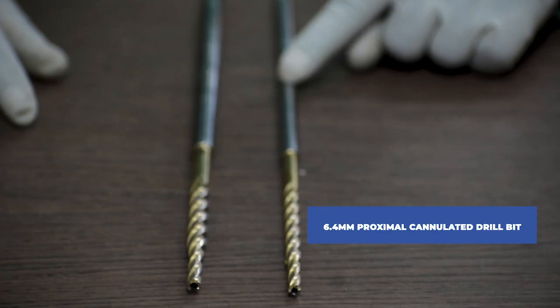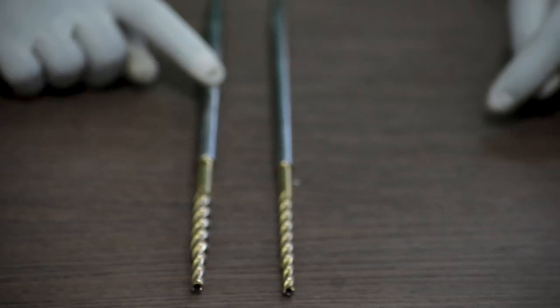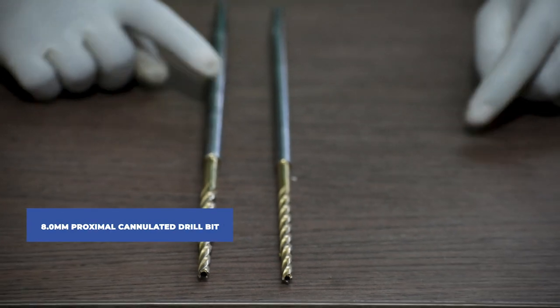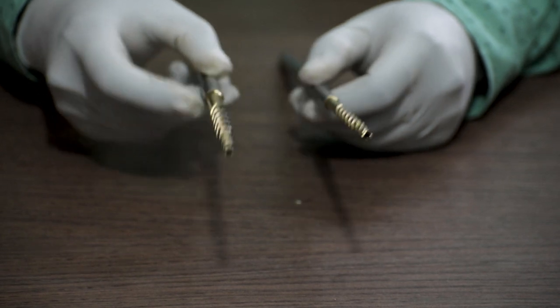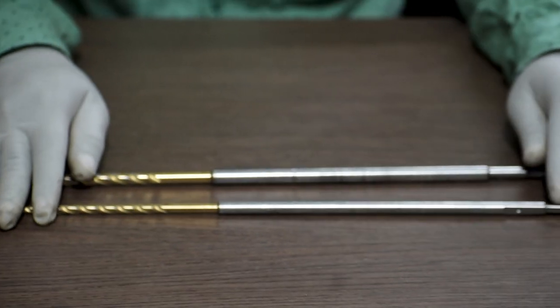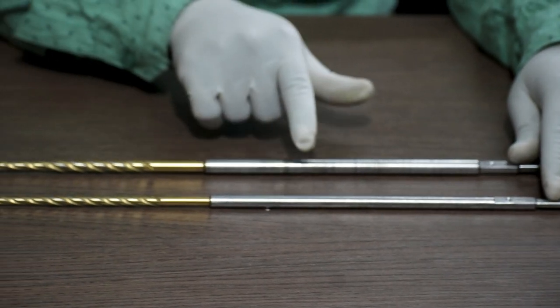Next is the T-handle chuck with key. This one is the 6.4 mm proximal cannulated drill bit, and this one is the 8 mm proximal cannulated drill bit. As you can see, these are cannulated. They also come with measurements — as you can see, there are markings on the body.